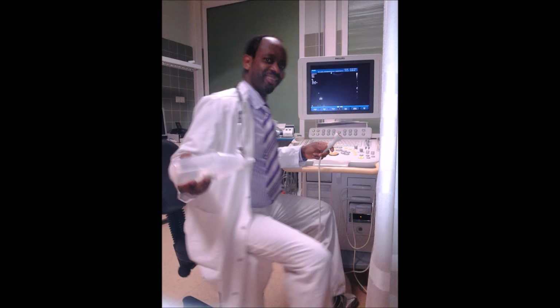I have a schematic diagram here which I will show you, which will help you to know if you need an ICD or electrophysiologic examination or none in cases of suspected Brugada syndrome type 1. If you have a spontaneous type 1 Brugada ECG, you need to know if it is symptomatic or asymptomatic. If it is symptomatic and you have a history of survived sudden heart death, that's a class 1 ICD indication, and we recommend an electrophysiologic examination to clarify if there is a particular tachycardia.